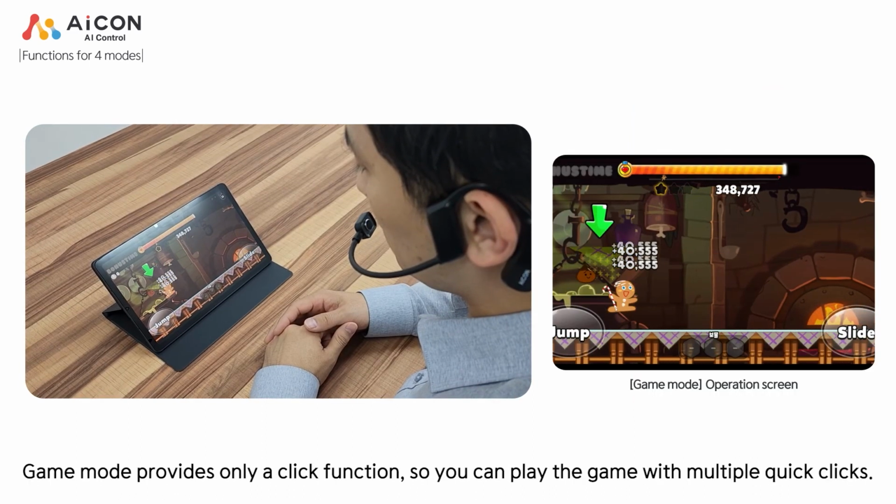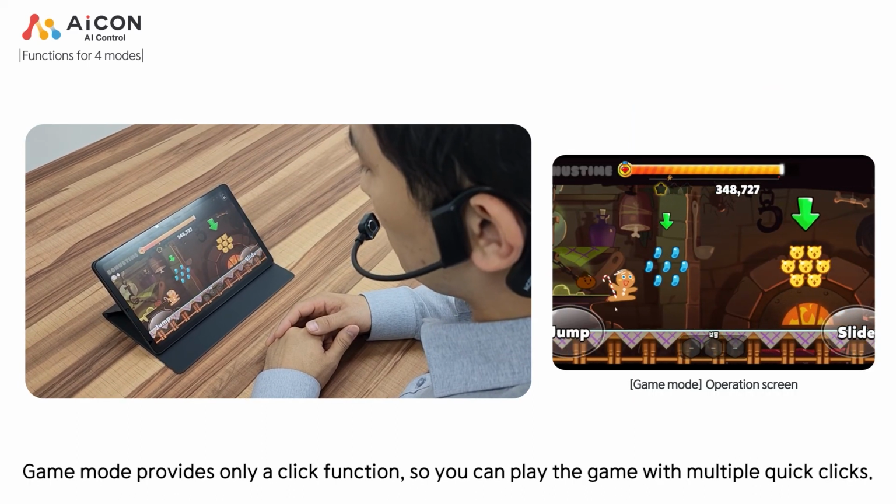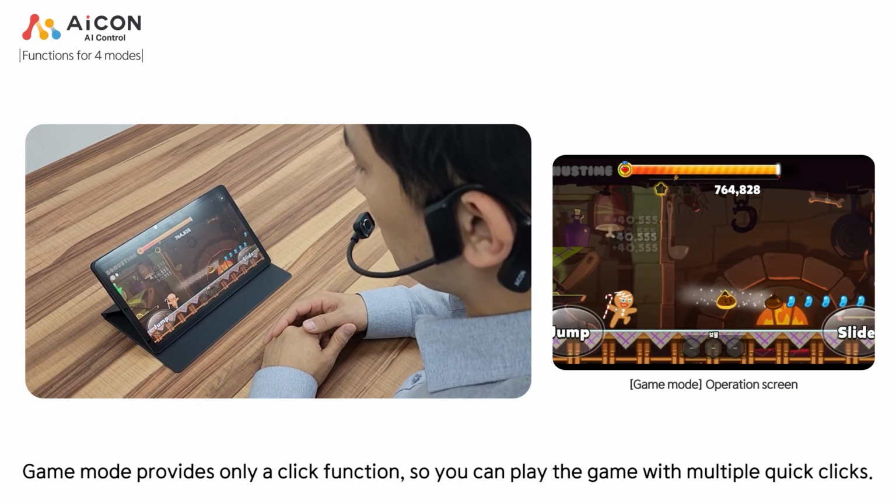Game mode provides only a click function, so you can play the game with multiple quick clicks.